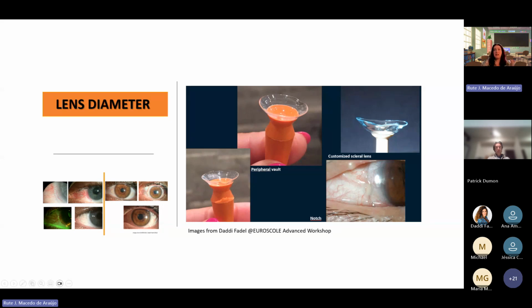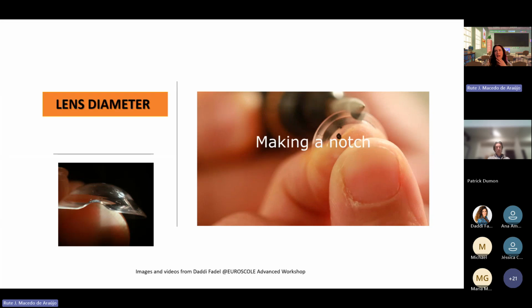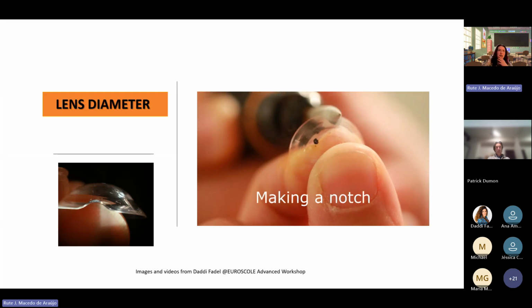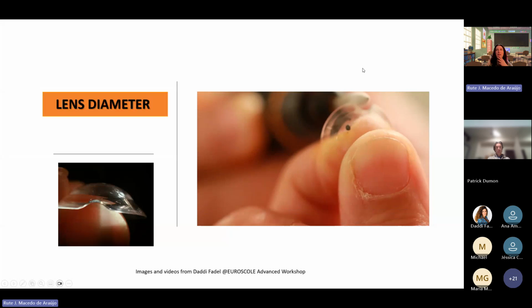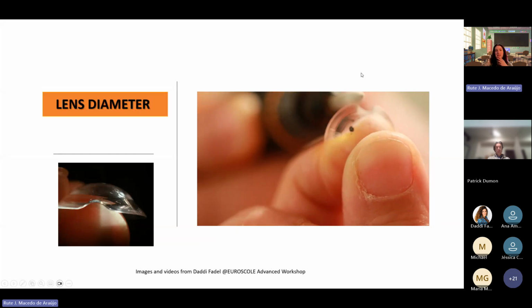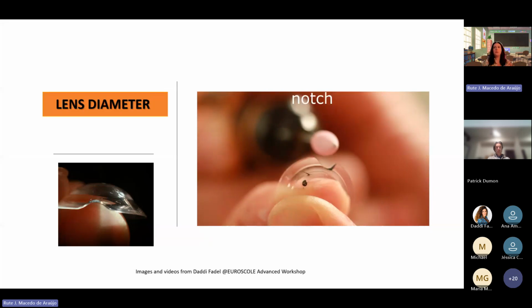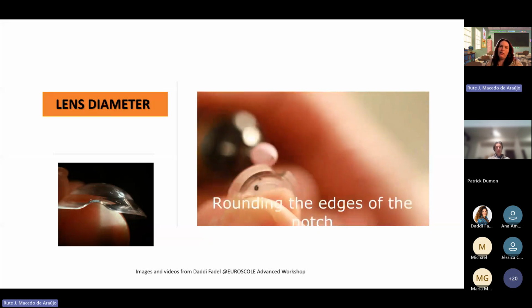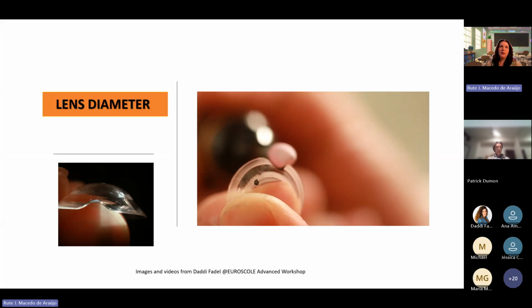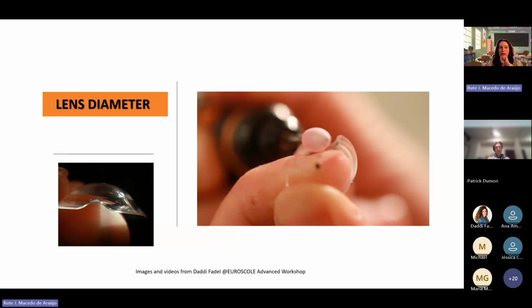And you can ask this of the manufacturer, or you can do it yourself if you want. Of course, as a researcher, I will tell you to ask the manufacturer, because when you are modifying something on a lens, this is something that is off-label. So there are some problems with that in some countries. But you can ask the manufacturer to do that. So these are the things about the lens diameter that we need to take into account.